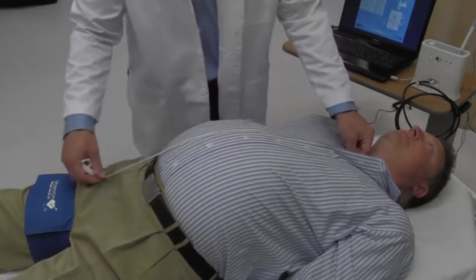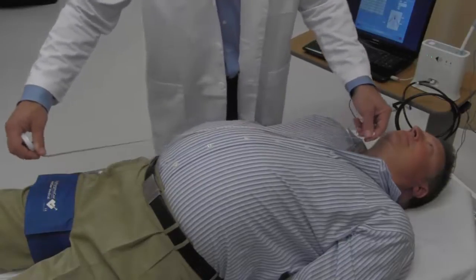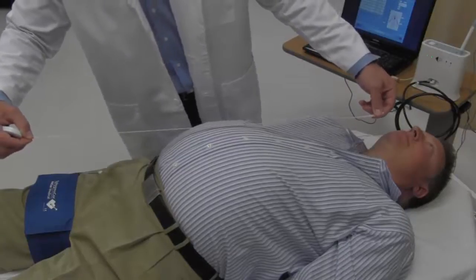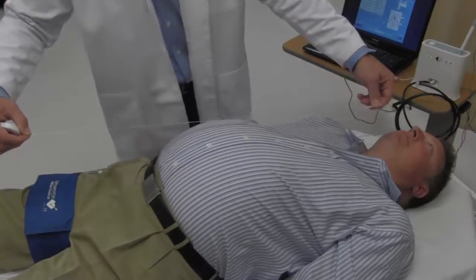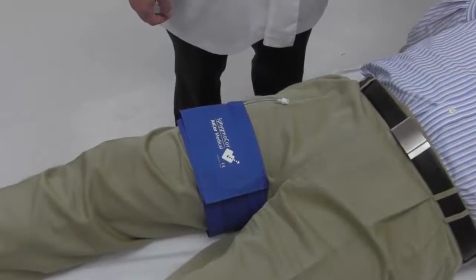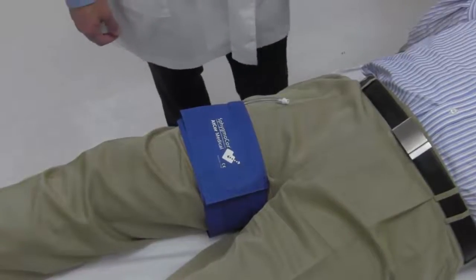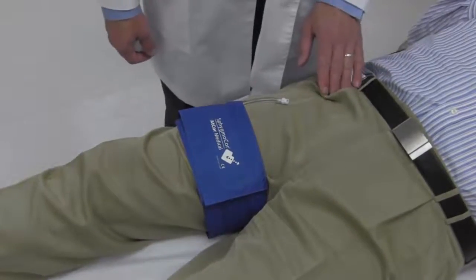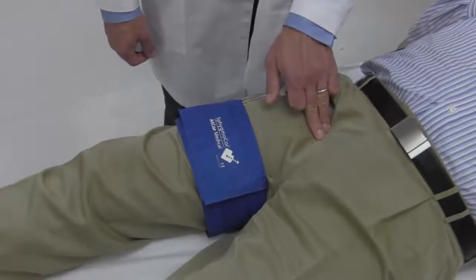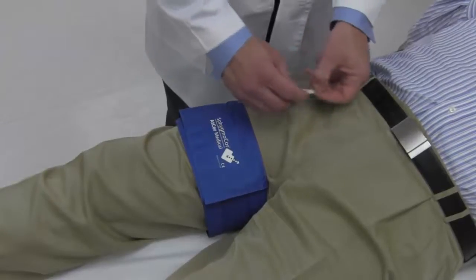For a more accurate distance measurement, lift the tape measure off the subject's body, keeping it in a straight line parallel to the surface the patient is laying on, and carefully measure in this manner. Finally, measure the distance in a straight line from the palpated location of the patient's femoral pulse to the top of the thigh cuff. The femoral pulse is best felt at an angle approximately 45 degrees inward from the hip bone by the groin or crease of the leg.